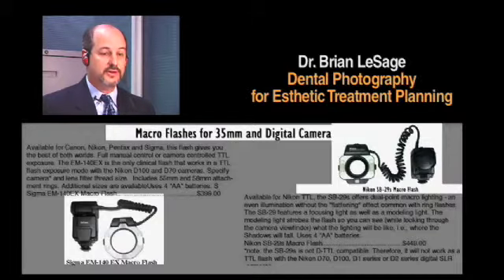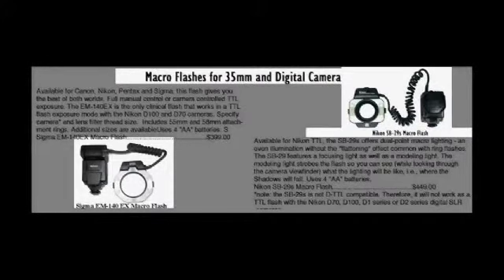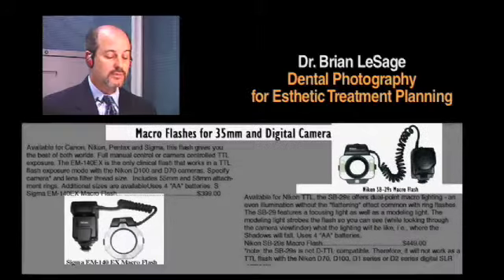And then when you get into the semi-professional cameras, your SLR cameras, we have several different options. This is your classic ring flash. The problem with ring flashes is they're good, and they're necessary for macro photography, but they tend to wash out our images, because you get a tremendous amount of light dumped on your subject at very close range, and so you don't get many shadows.